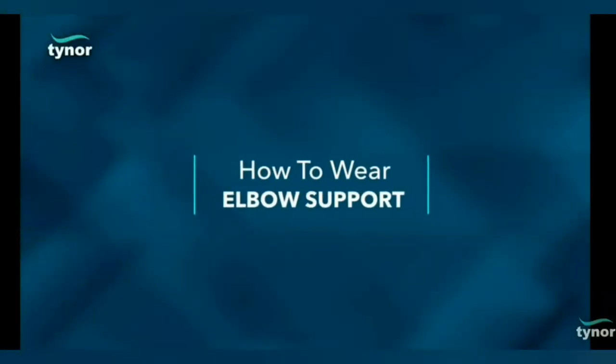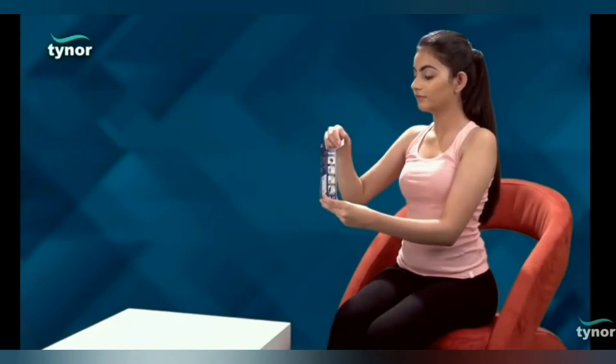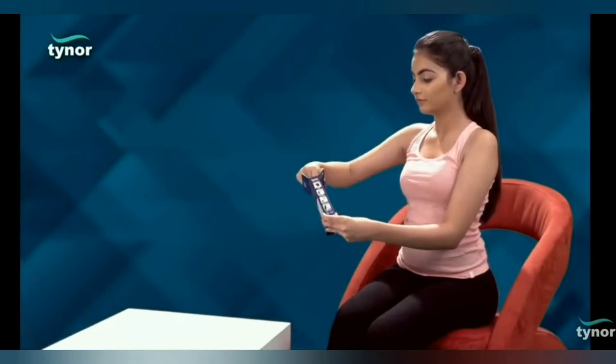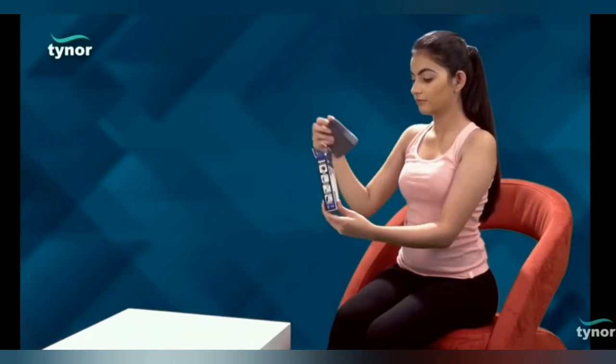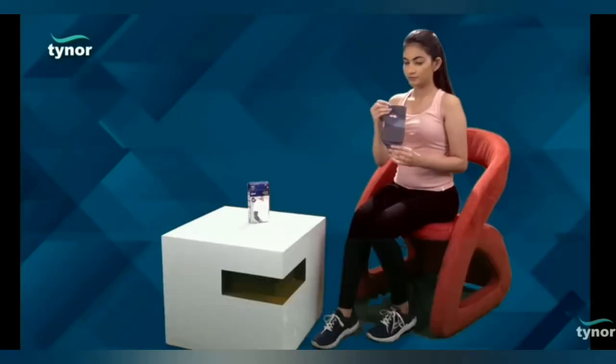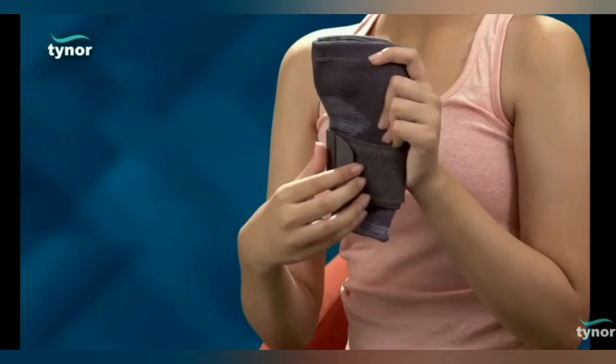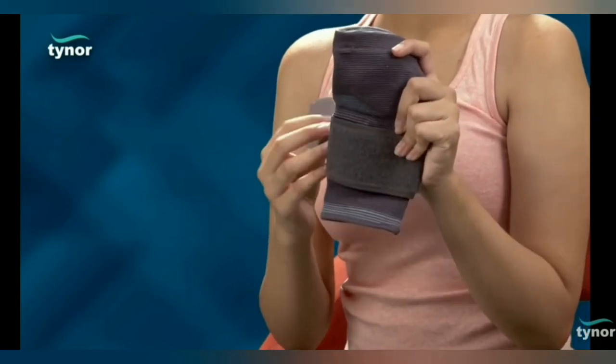Now, let us see how to wear the elbow support. The longer and broader portion should be facing upwards. Disengage the Velcro strap to make the product ready to use. Slide the product from the broader end onto the arm with a pull-on action.